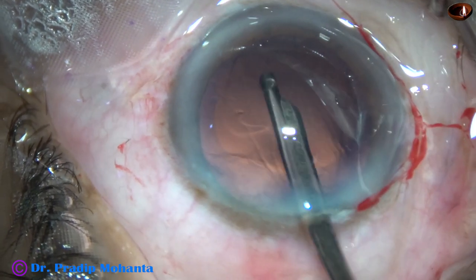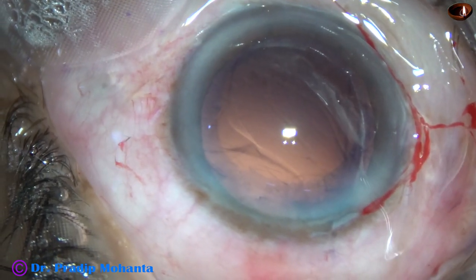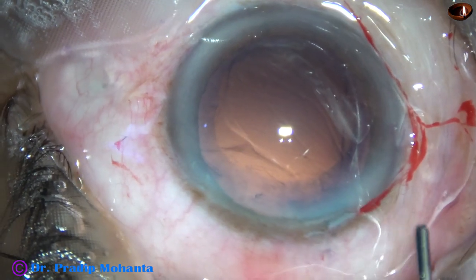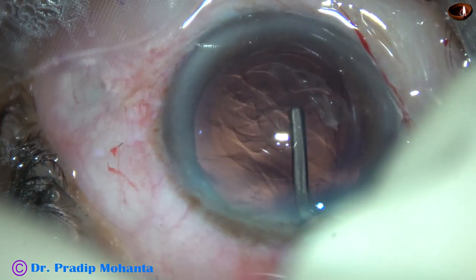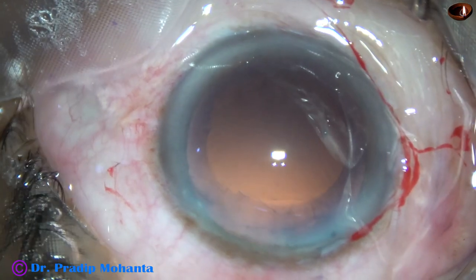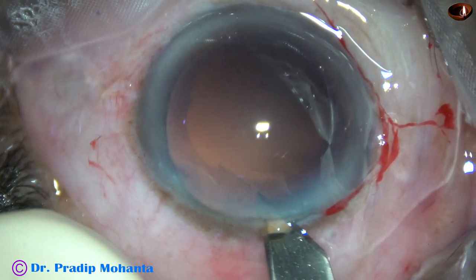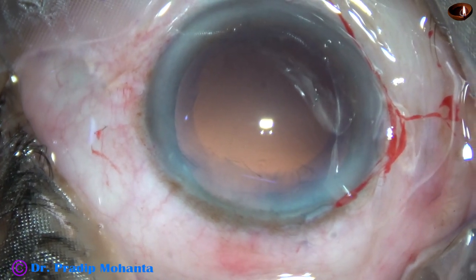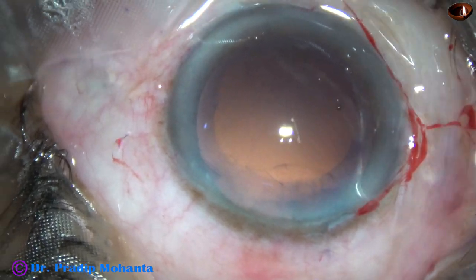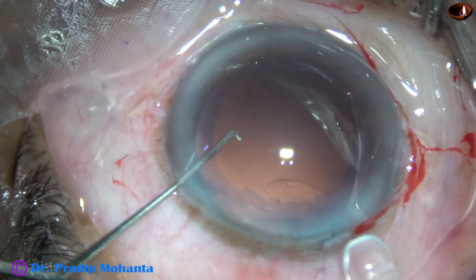Though there is a CTR, there is hardly any cortex because the lens was hypermature — peripheral cortex was liquefied. And now is the time to implant an intraocular lens. I have filled the capsular bag as well as the anterior chamber with 2% HPMC. I enlarged the main wound a little bit, say by 0.1 to 0.2 mm. And here goes a hydrophobic, single-piece, monofocal, aspheric intraocular lens.